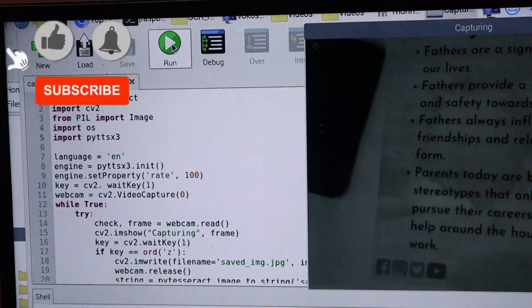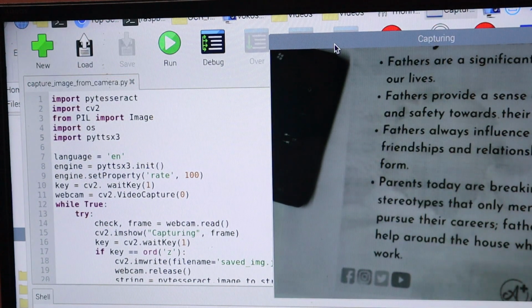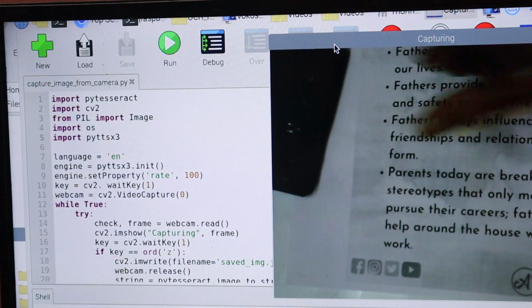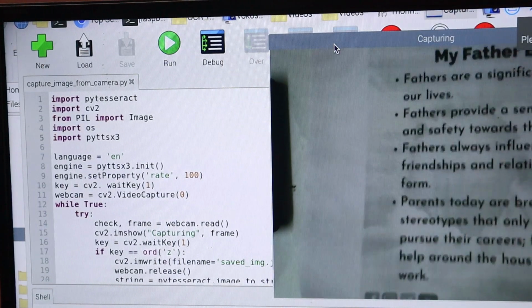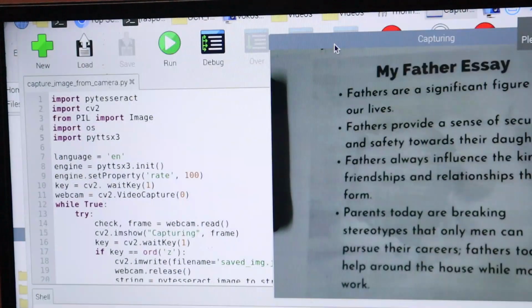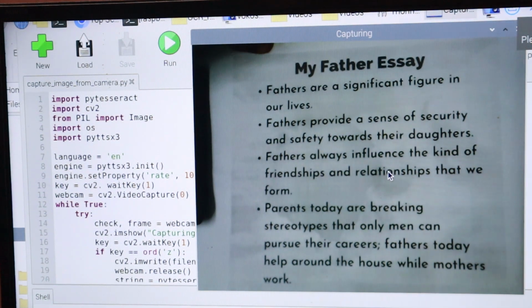Once you click on this run button, you can see the camera start capturing my image. Just adjust the page correctly. Once you adjust the page, you can see on the screen that the page is correctly visible. After that, click on the Z button on the keyboard. I will press the Z button right now. Once I press the Z button, you can see the image is captured. It is frozen now. You can see my finger.